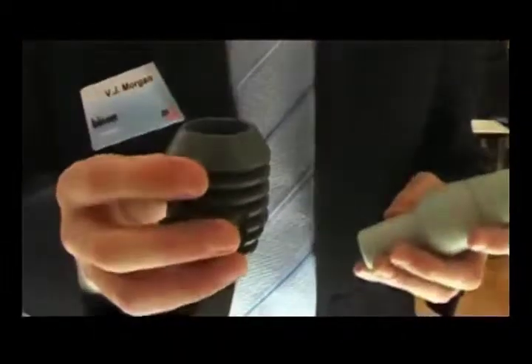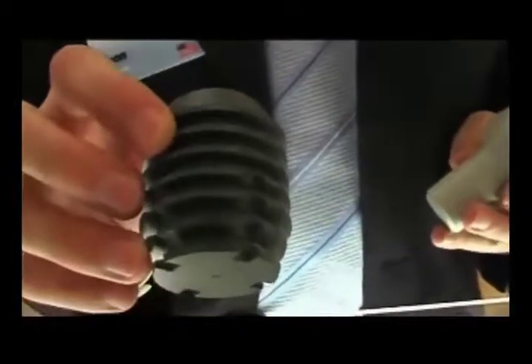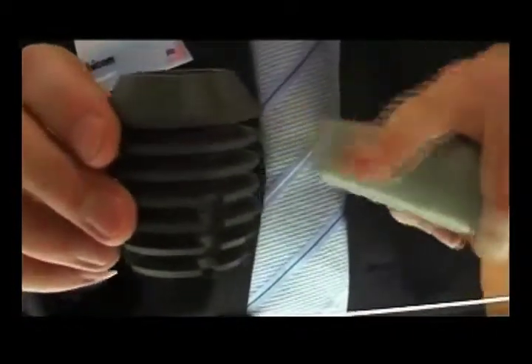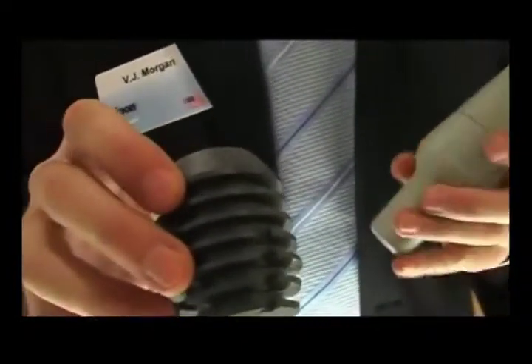This is the Bicon implant, and it is not a screwed-in implant. It has these plateaus, which provide greater surface area for the integration of the implant.